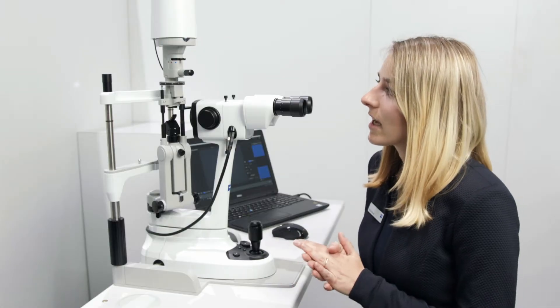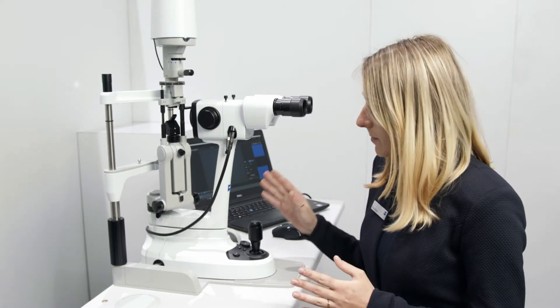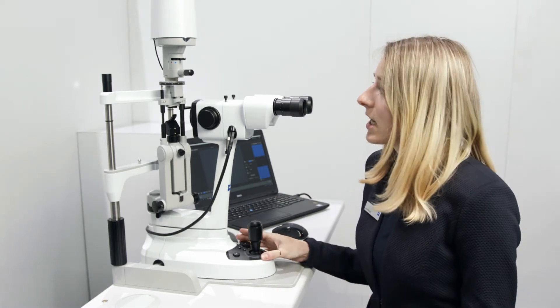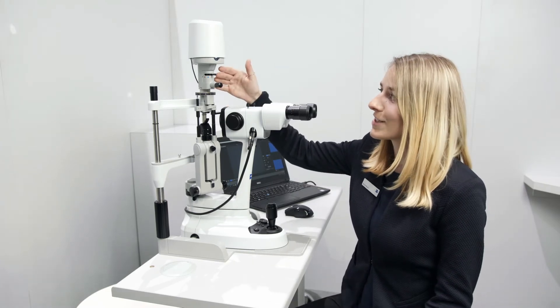The SL800 has three major improvements. First of all, it comes with best-in-class ergonomics, superior optics, and advanced illumination.